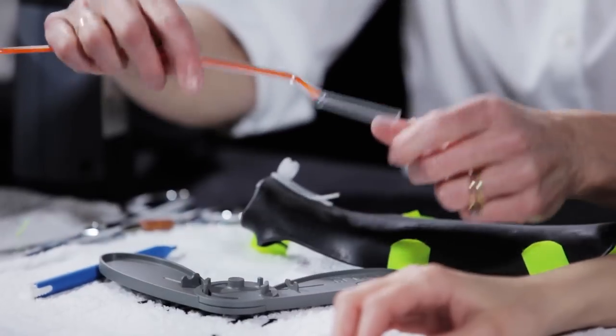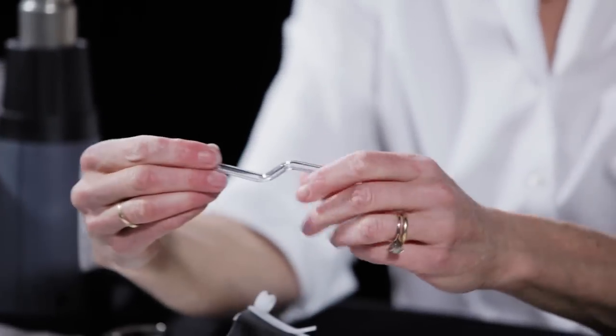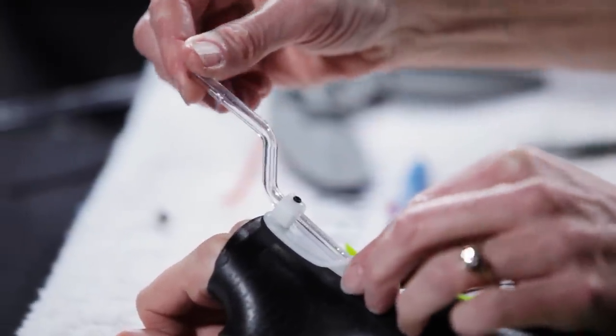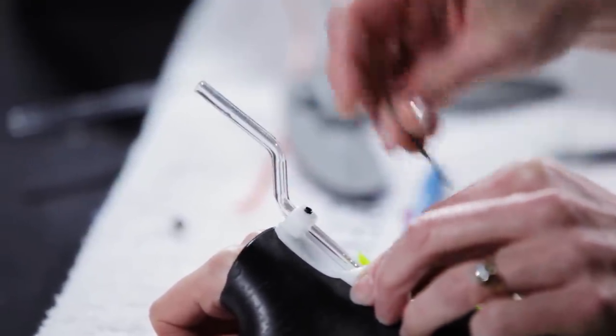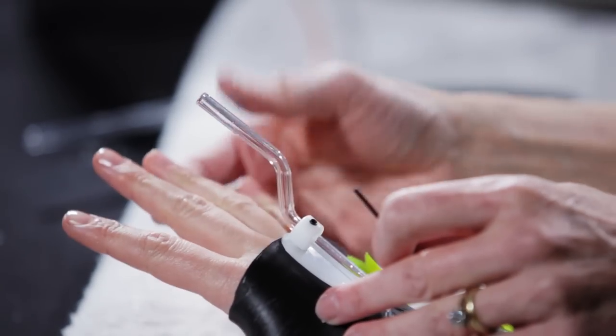Place the OrphiTube in the OrphiTube adjuster on the orthosis and secure with the Allen wrench. Using the Allen wrench, position the finger so that the OrphiTube is at a 90 degree angle to the proximal phalanx.